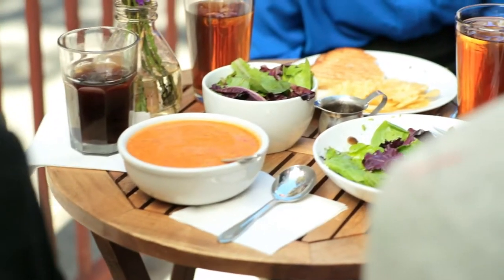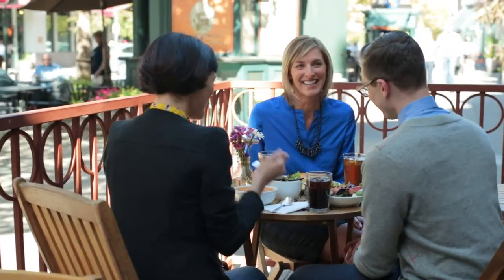If you're eating or drinking anything other than water, you'll need to remove your aligners to protect them from damage. It's also a great opportunity for good oral hygiene.